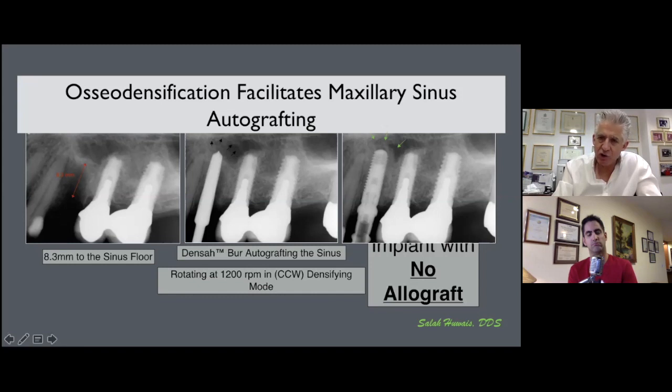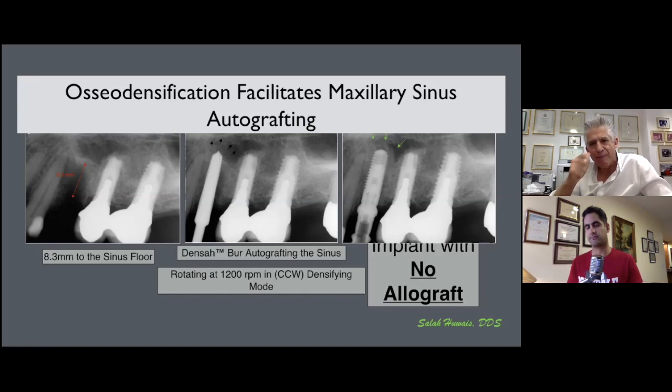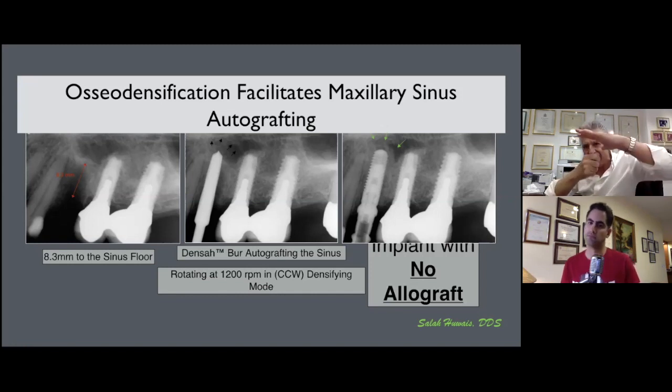A clinical or surgical tip, when you are drilling, let's say with your 3 millimeter drill, so we reach the floor of the sinus. Of course, take x-rays along the way to see where you're going if you're not sure. Take periapical x-rays. When you reach the floor of the sinus, because the floor is cortical, you will feel and hear, both feel with your hand, with a handpiece, and you will also hear a vibrating sound. And that's the tip of the densifying burr hitting the floor of the sinus, which is cortical.